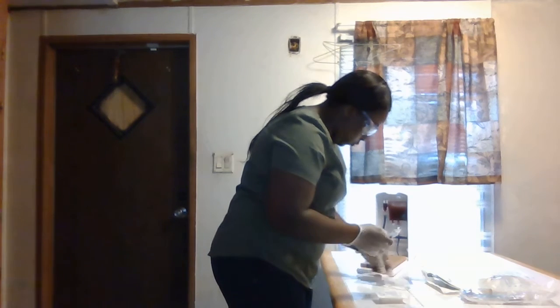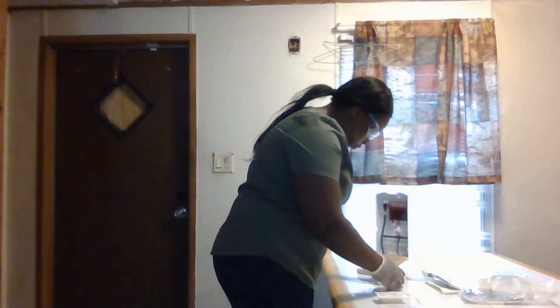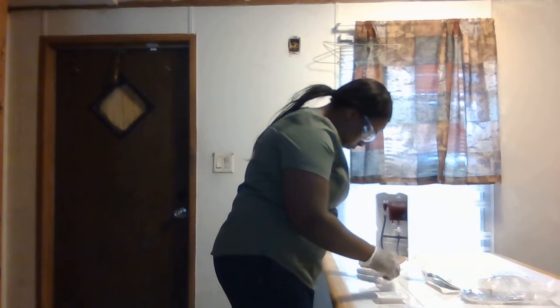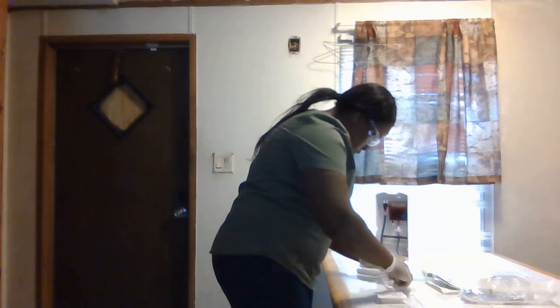Okay, and then now I'm going to attach my syringe to my extension port. I don't have to clean this off because it's considered sterile in this package. So I go ahead and attach my syringe so that it's ready to go. Now at this time, I'm going to go ahead and prime the extension.